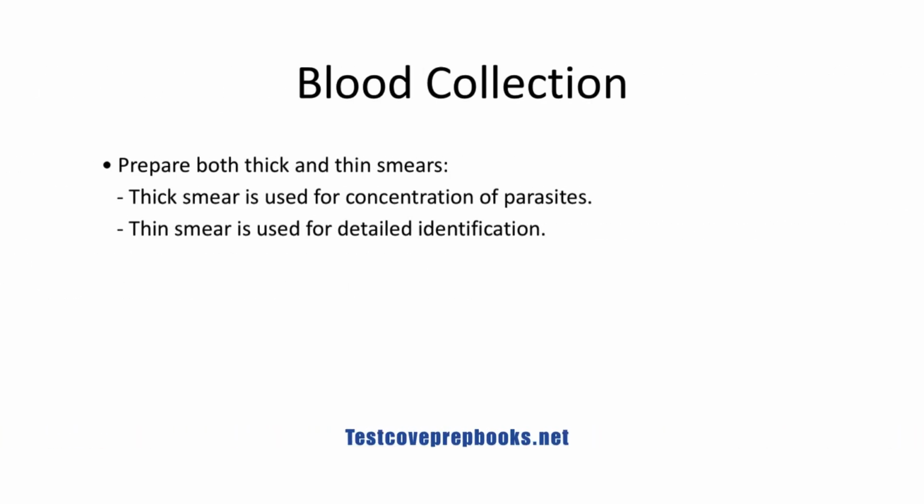For blood specimens, both thick and thin smears are prepared. The thick smear allows for concentration and easier detection of parasites, while the thin smear provides the necessary morphology for species identification.